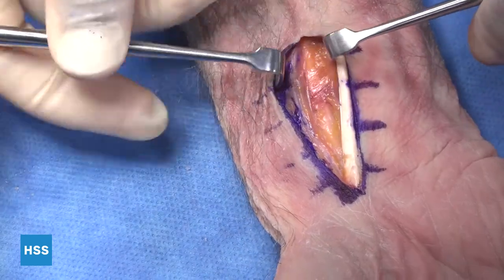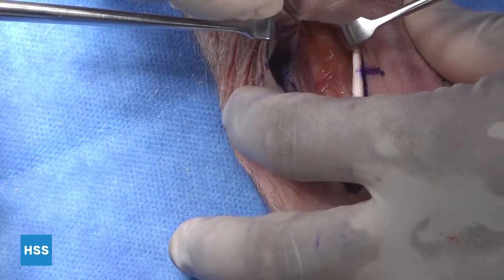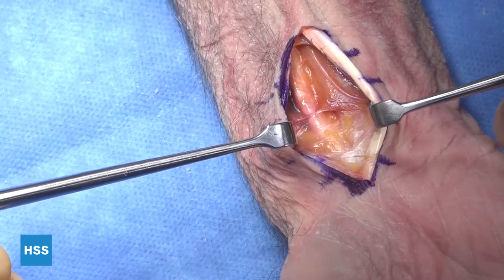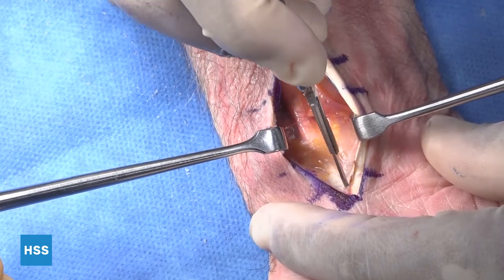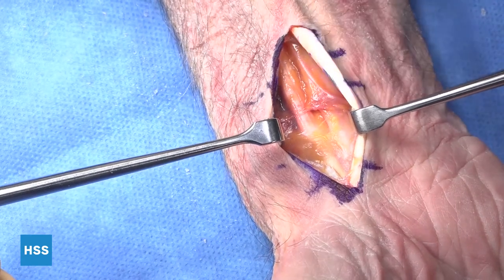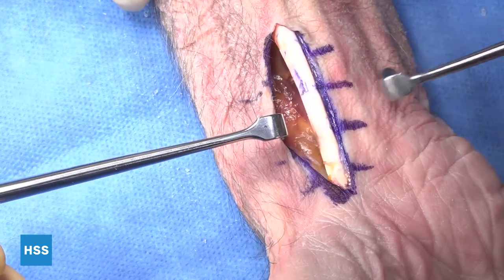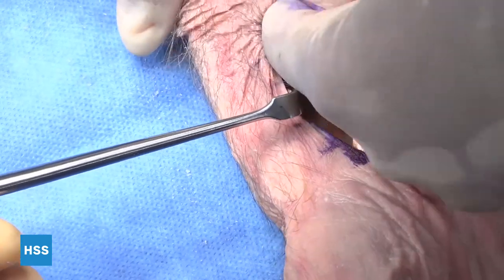We'll look proximally to make sure we're all the way through and satisfied with our dissection, and then go distally to make sure we're happy with exactly where we are. At this point, we're ready to actually expose the next layer. You can do this through several different ways — you can bluntly use the back edge of your retractor, or you can also take a finger and sweep generously to reveal the next layer.